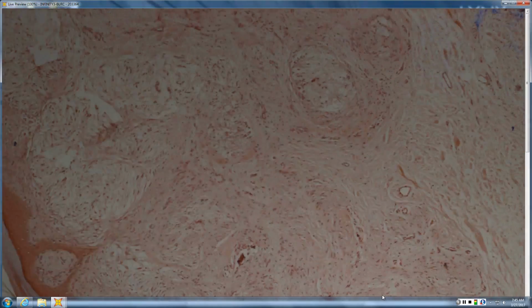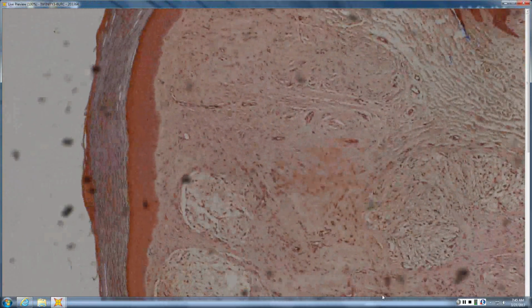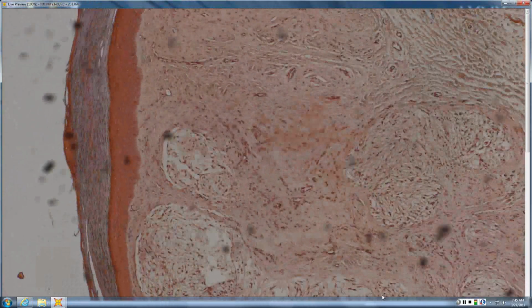The non-neural granular cell that has the different name, how does it look different? So non-neural granular cell tumors are related, most of them, to plexiform fibrohistiocytic tumor, and they don't have the giant lysosomal granules. So that's the biggest hint at scan, is if you don't have those big giant lysosomal so-called pustulo-ovoid bodies, then you start thinking of non-neural granular cell.